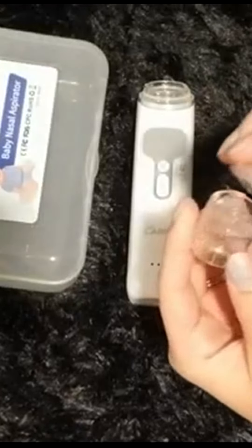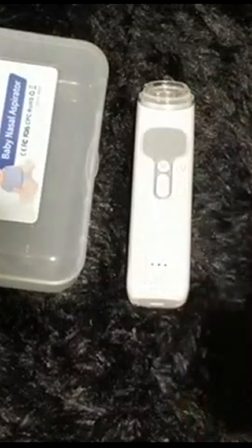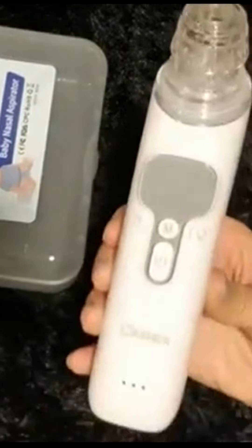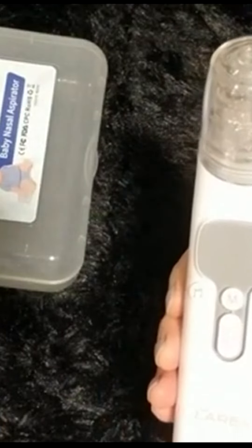First, take the collection cup and the sealing cover and put those two together. Then take those two pieces and put them onto the main base on top — it just twists right in there. Then take the storage bin and place that on top.